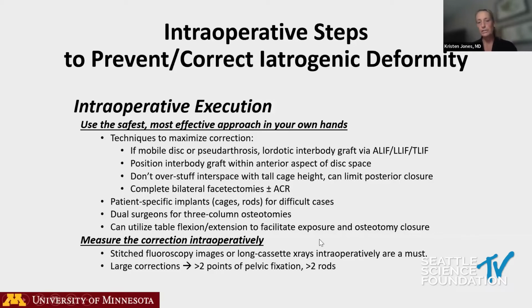Dr. Gupta had mentioned in his talk basically table-based correction with a hinge table. We do utilize the table that he depicted. Also, there are many different options you can use, but I think that really helps in avoiding stress on the implants during deformity correction.